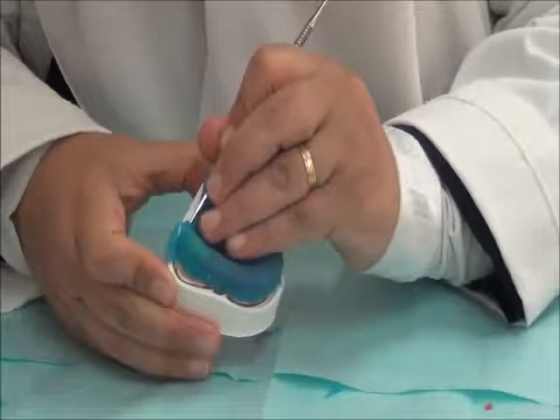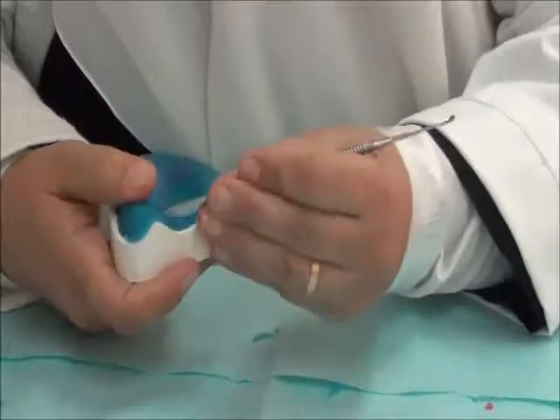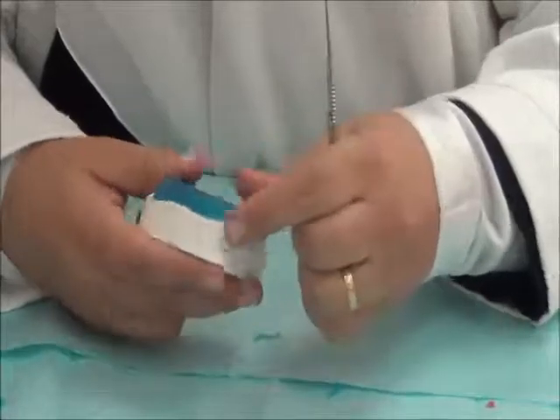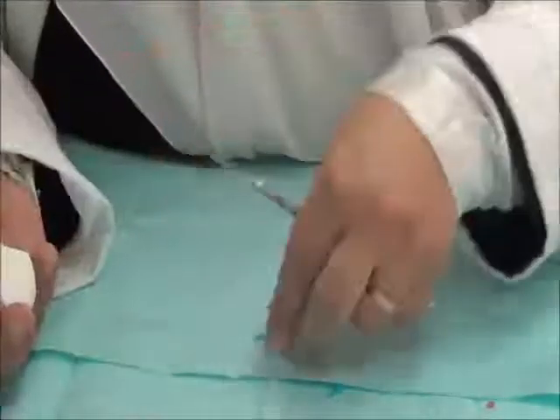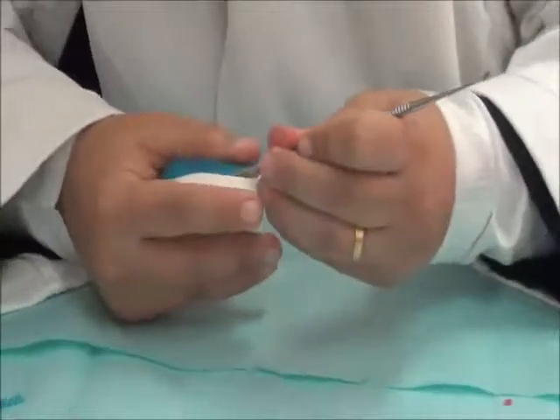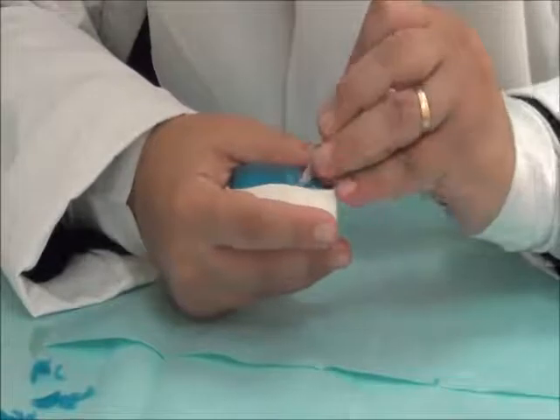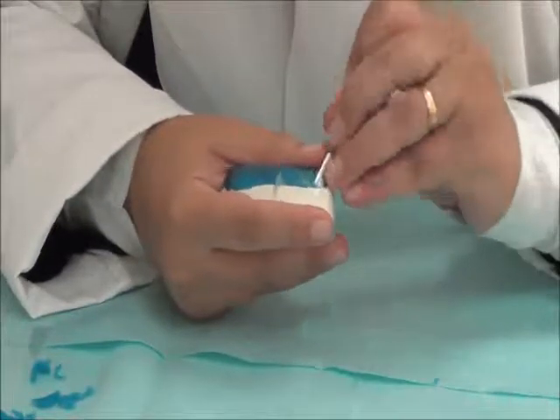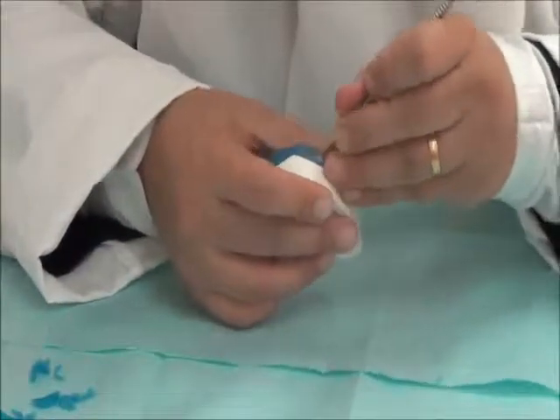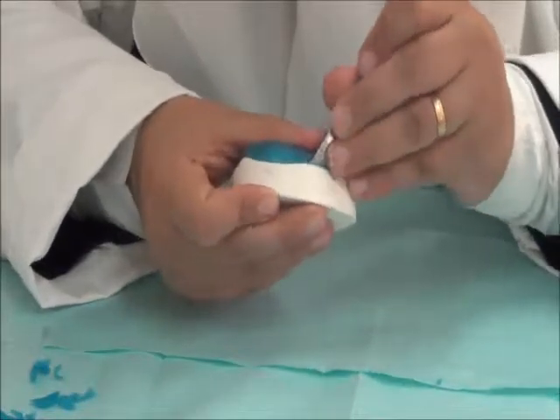We have the material inside the hamular notch, straight to the other hamular notch area, so it's included in the borders of the tray. You can see that we're taking our time because the material will stay soft and can be adapted all throughout the time until we light cure it. But that doesn't mean that you work with it for a long time, because the light from the room itself might initiate some reaction. So it's better to finish it off as soon as possible.